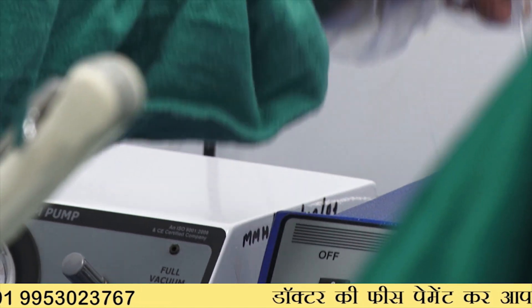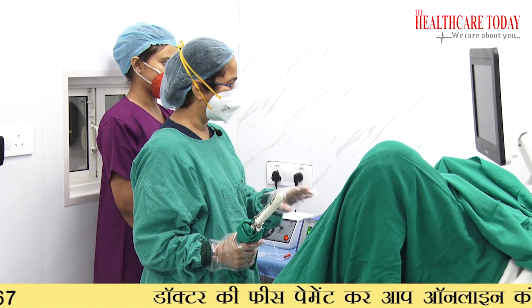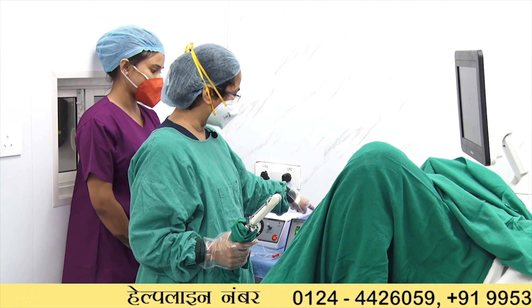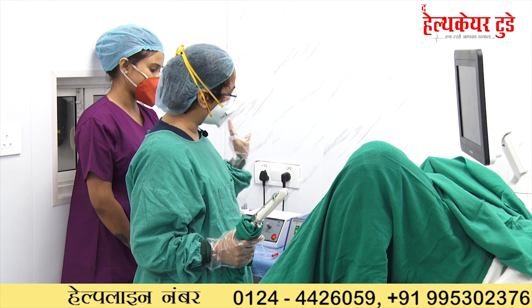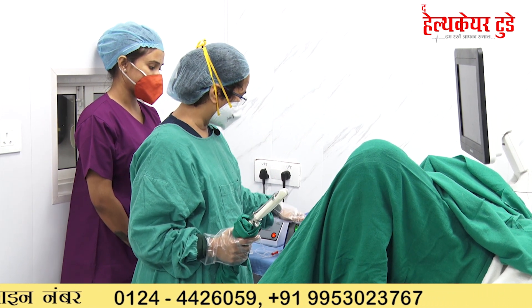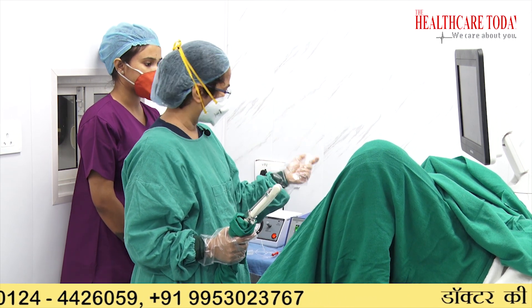This is the dry bath in which we put empty tubes and media. The oocyte retrieval follicular fluid is going to be collected here, so you can check those follicular fluid samples. This has to be given to the embryologist and maintained at proper temperature, which is why it is done in a dry bath — you cannot hold it in your hand and collect the follicular fluid.